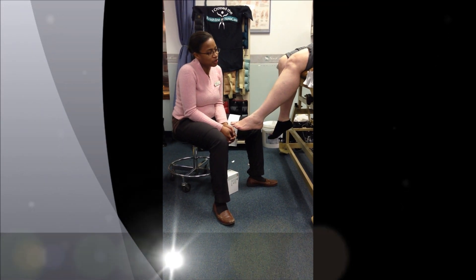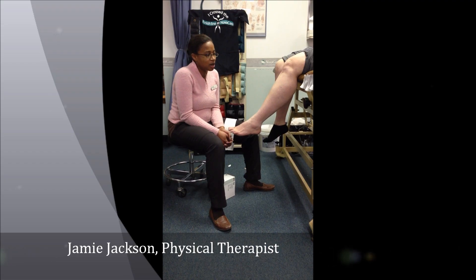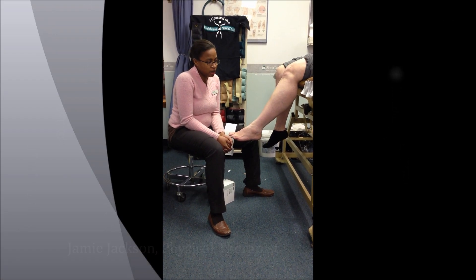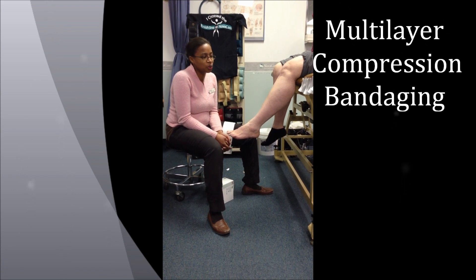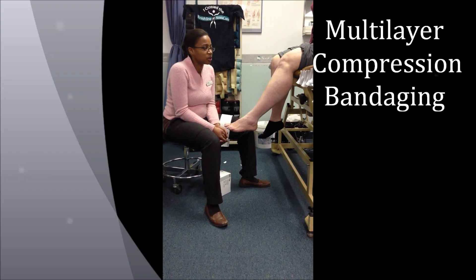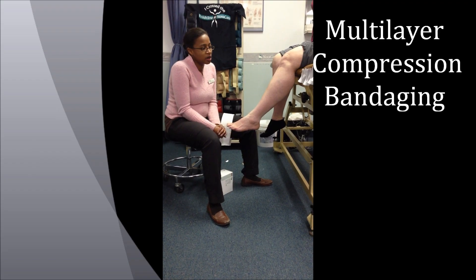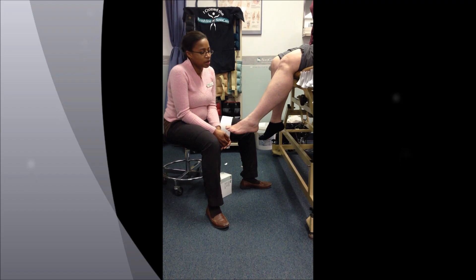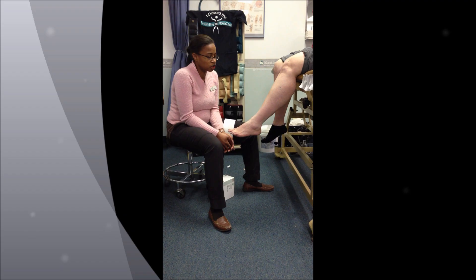Today we are showing how to wrap the lower extremity to the knee as part of your home exercise program for wrapping. Just for the purpose of this video, we will not show you with the foams. However, if you do have foams, be sure to either see how they are attached from your physical therapist, or else another video with the foams may come later on in our session.